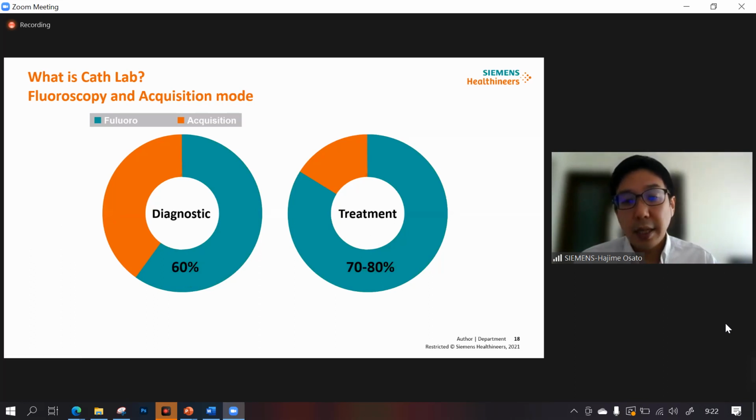But if we use too low a dose setting, the image quality also gets worse. So we have to look for an acceptable lower dose setting by collaboration with application specialists in the vendor. The dose and image quality is quite a relevant subject in the clinical case.